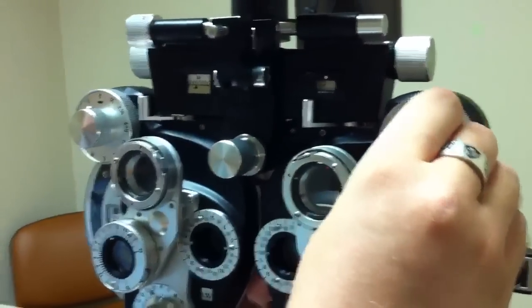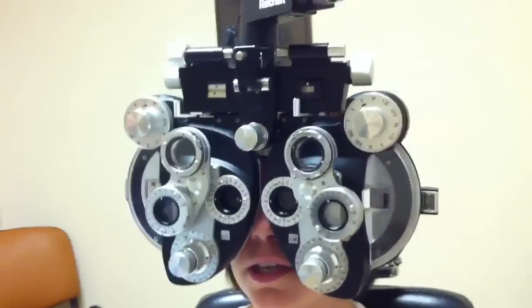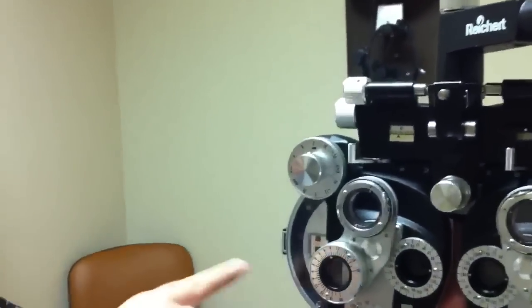We're looking through the right eye. What's the smallest line you can see? E-V-O-T-Z. Okay, so she can see 20/20, so we don't need to go too far with the prescription.